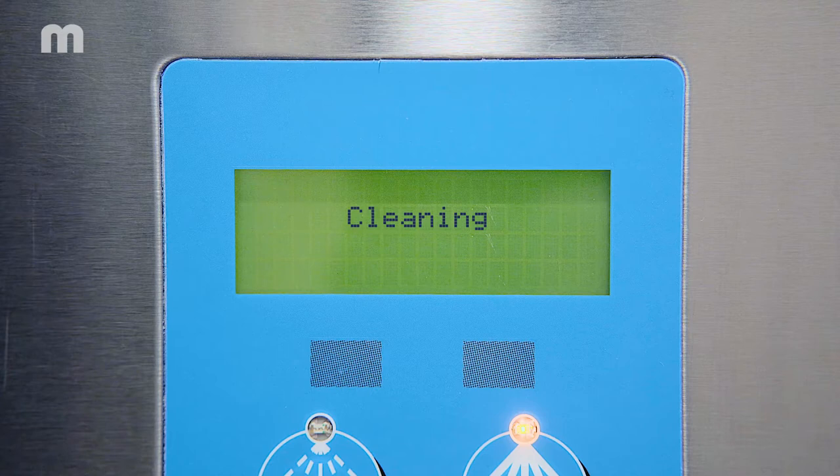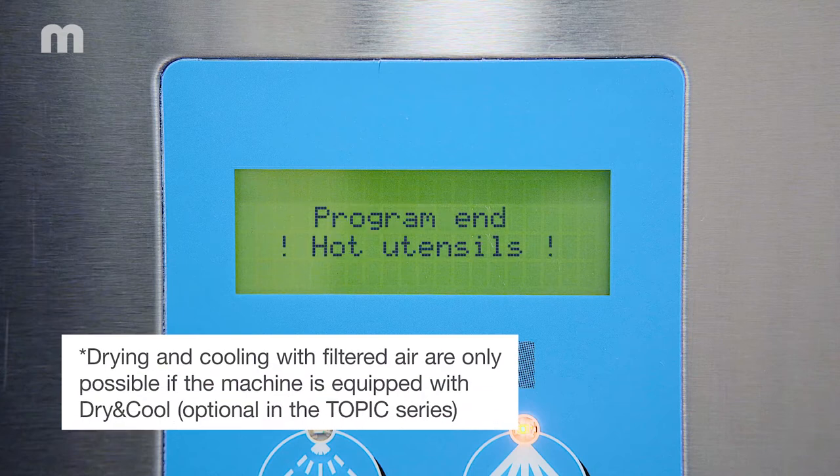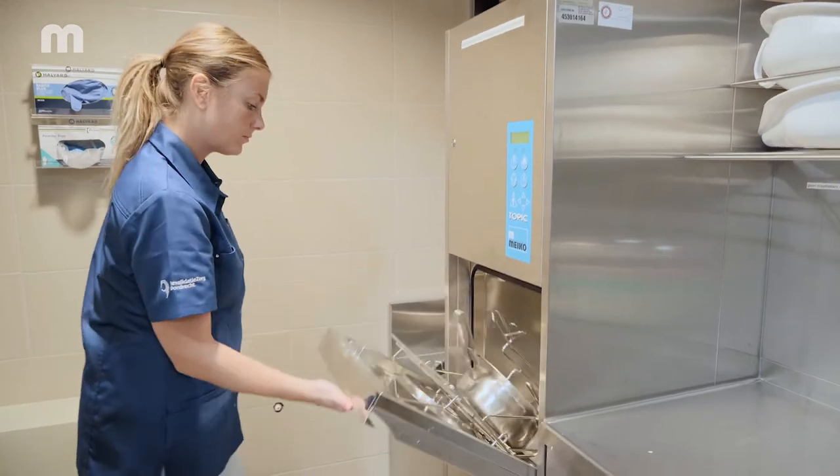When the appliance starts, the care utensils inside are automatically cleaned, disinfected, dried and cooled. The AO value is adjustable and can be set from 60 to 3000.